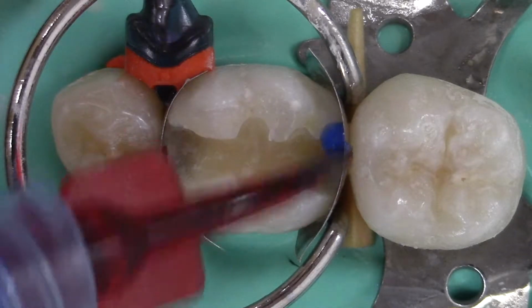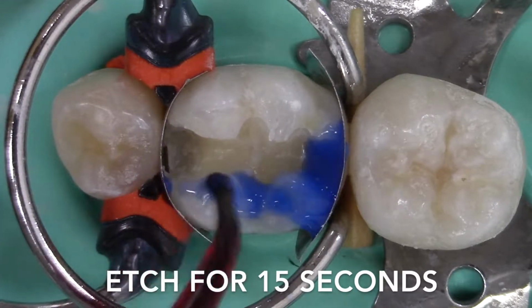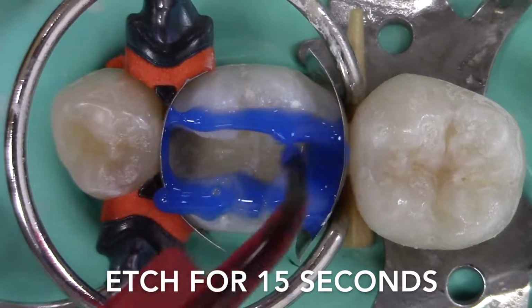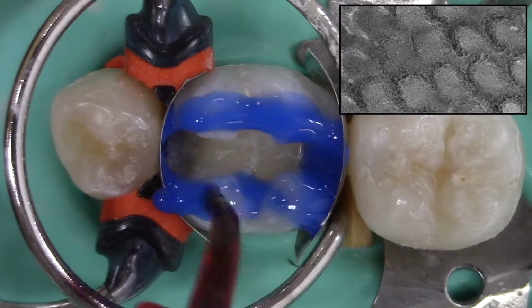37% phosphoric acid is applied to the enamel margins, and the etchant is agitated with the etchant tip to spread any formed bubbles. Application of phosphoric acid creates a favorable etch pattern for micromechanical retention of the adhesive.